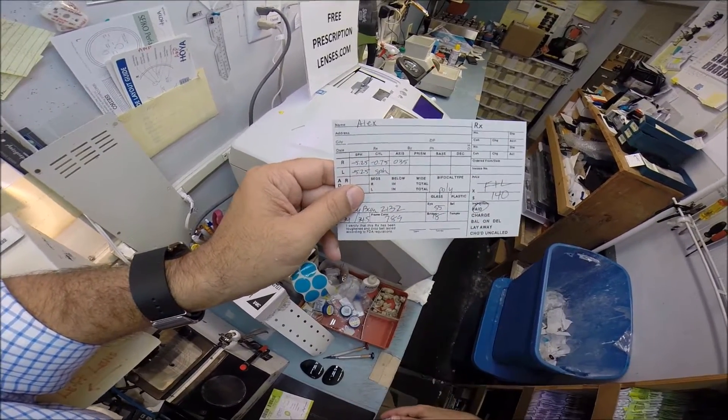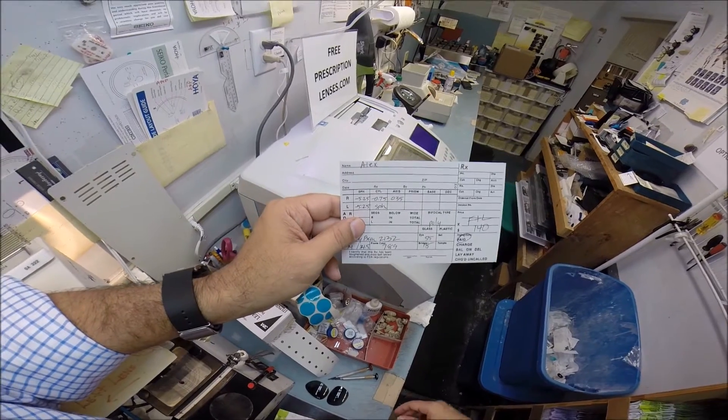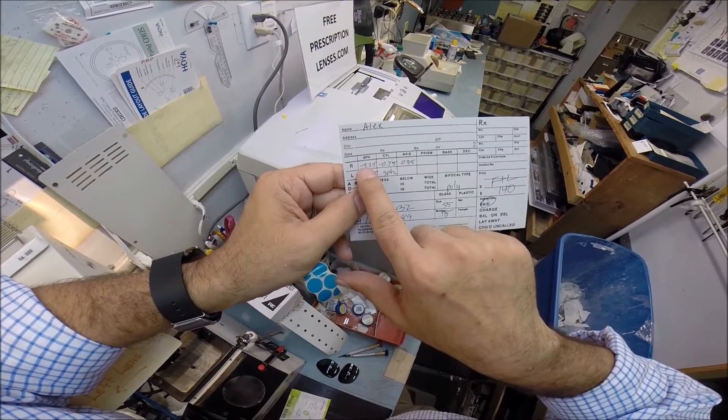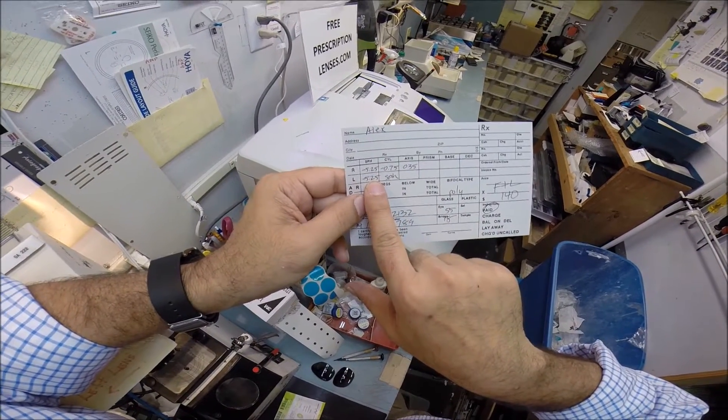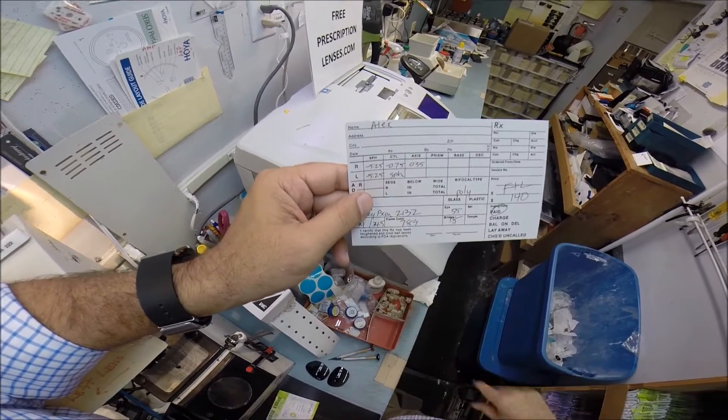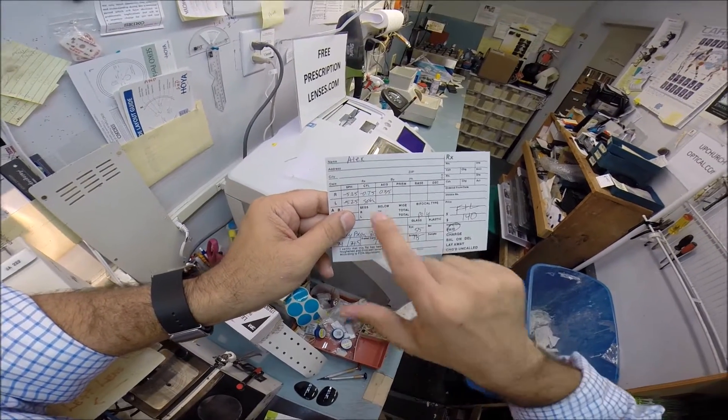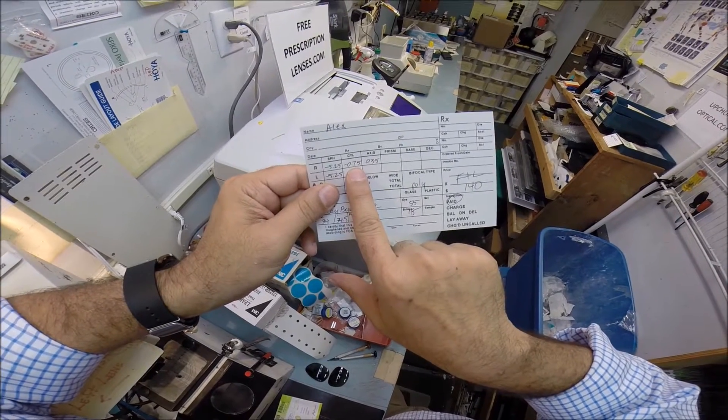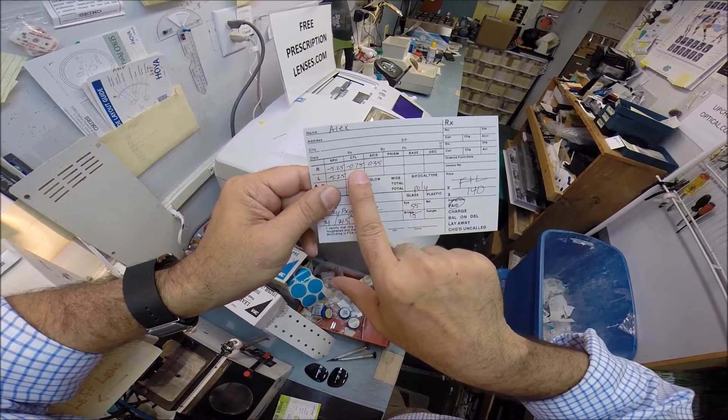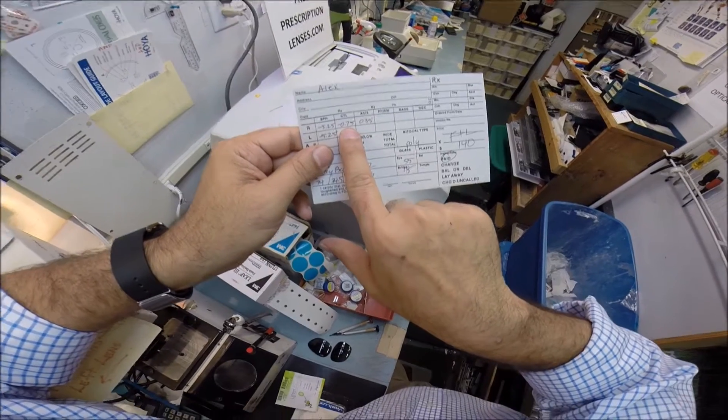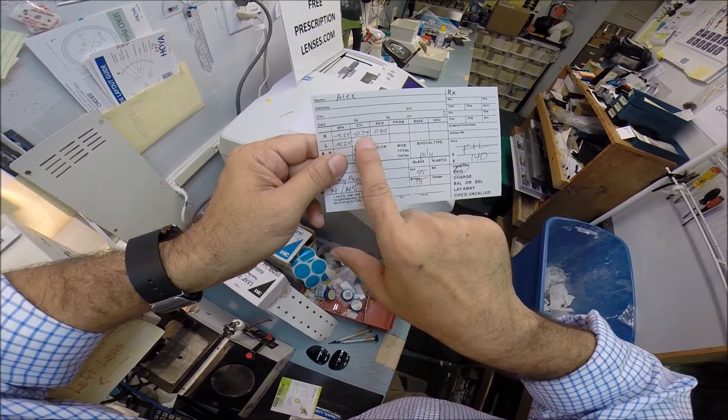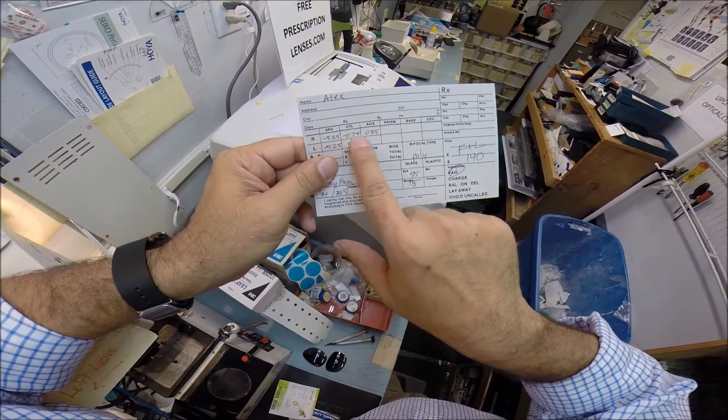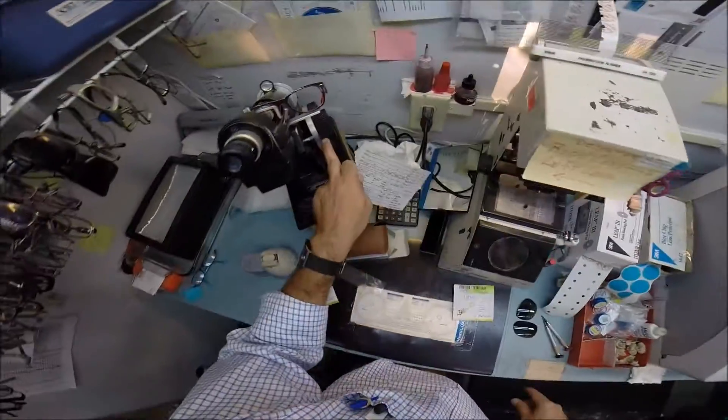Without your glasses on, everything is much too large in real life. So, when you put your glasses on, that minus sign, it will minify, which is the opposite of magnify. Your lenses will minify to the correct size. Now, you still have a little bit of fuzzy edges. Your astigmatism is what makes 6s and 8s look alike, or the letters P and F. So, that's why you have a combined 24 steps of correction, combined power, where we get the minus 6.